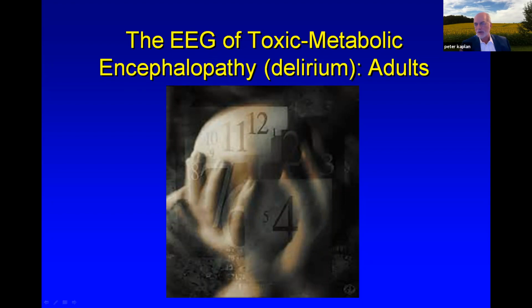So let's take a typical scenario: ICU, no clinical exam because the patient is paralyzed and under anesthesia, and the cause of the status, let's say, is head trauma.